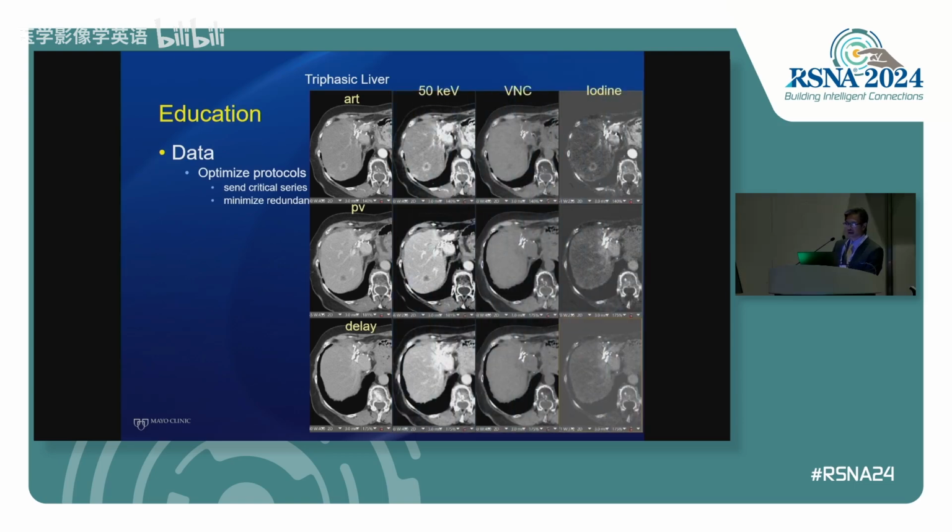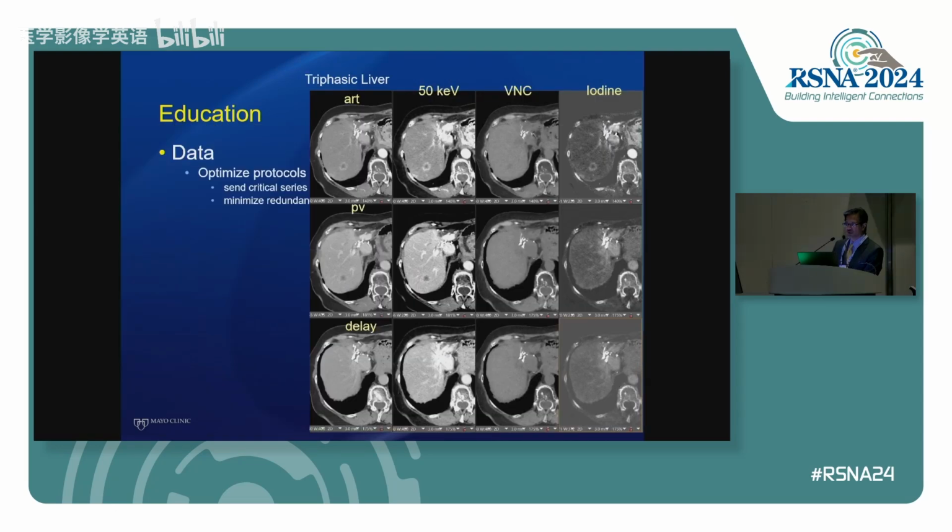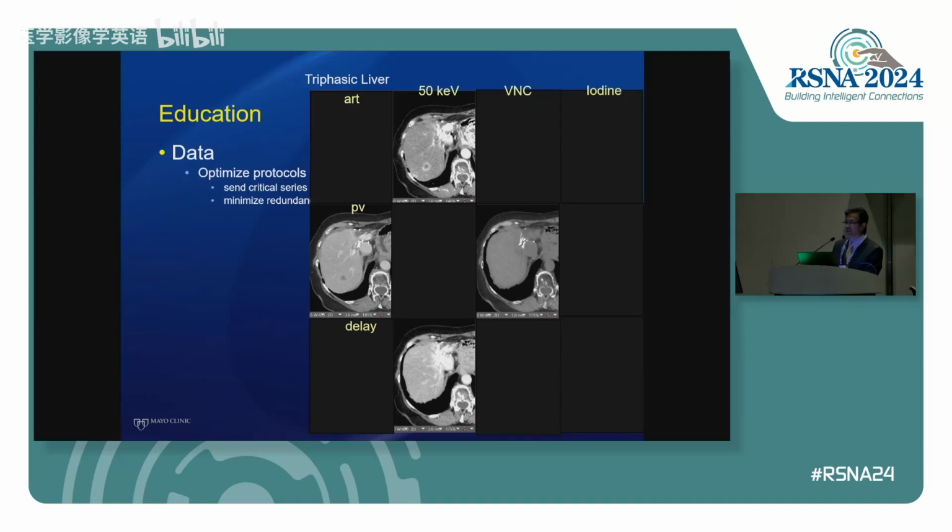And then if you add all the dual energy CT displays that our first speaker mentioned, that really now balloons to 12 series. But as I alluded to earlier, we don't necessarily need to have those. There are best practice guidelines on what to send to PACS and what's going to be important. And so instead of having 12 series, we can actually bring that back down to 4.